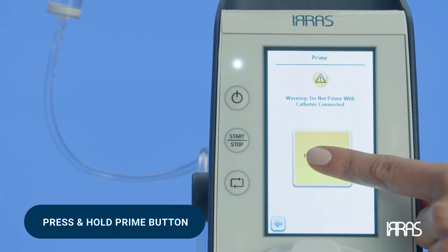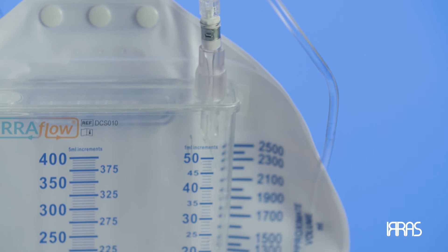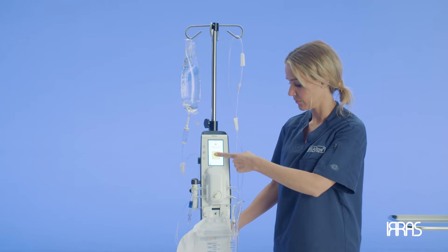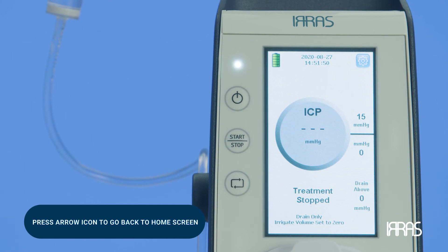This will take approximately 40 seconds. You are done priming when you observe fluid in the drainage bag. Priming is done to create a fluid-filled system so that when you connect the tubing to the catheter, there is minimal need to open the system during operation. When priming is complete, stop pressing the Priming icon and press the arrow icon to go back to the Home screen.